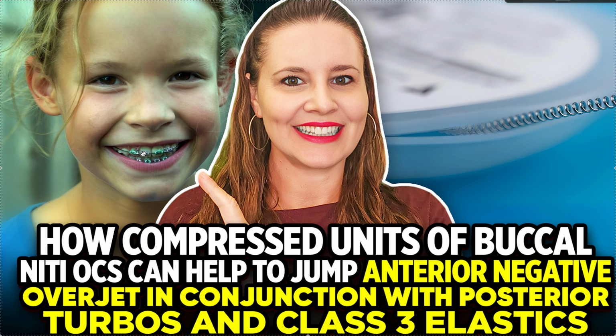That is then going to do one of 2 things. One, it's going to provide a force that pushes these out. Secondarily, it's going to provide a force that pushes the back. You might not want that. So if you don't want it to slide back, then you're going to have to cinch your molars. That is the key. Otherwise, half of it's going to go forward, half of it's going to push back. Other option is to have something in like a Nance or a TPA, which will provide anchorage if you're not going to go ahead and cinch it. So cinch or an appliance.